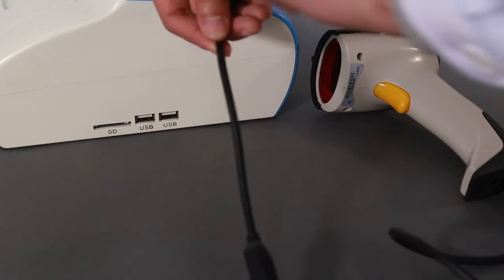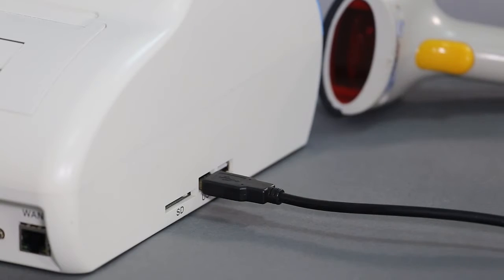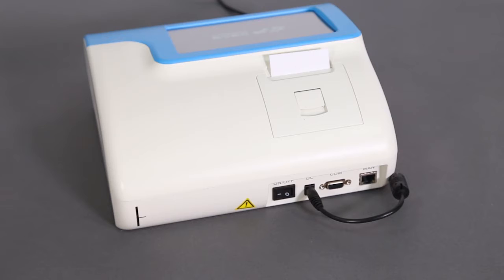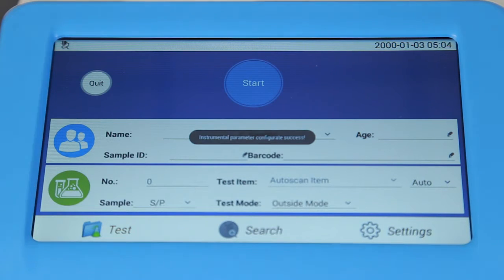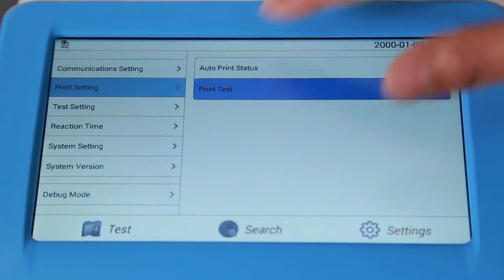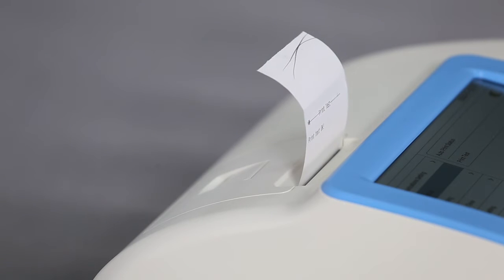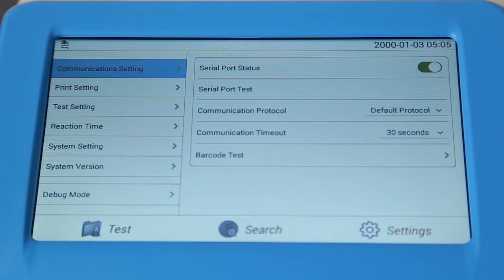Connect the barcode scanner to the USB port of the analyzer. Connect the power supply and the barcode scanner — which is optional — before turning on the analyzer. The analyzer will automatically start up the self-test program and display the main interface. Click Settings, then Print Setting, to choose auto print, and then click Test to confirm the printing paper is successfully installed. Communication Setting is used to set the communication status and to test whether the barcode scanner is working properly.